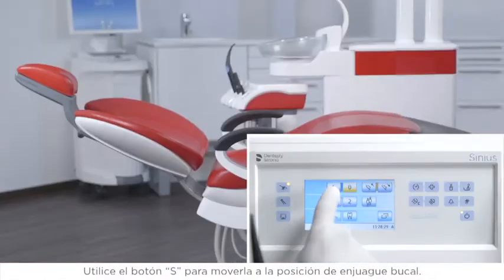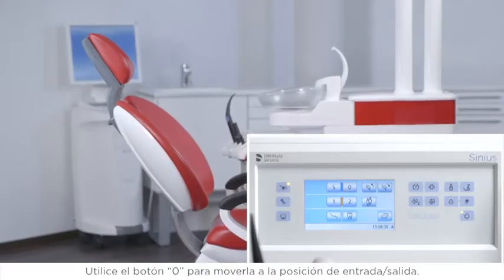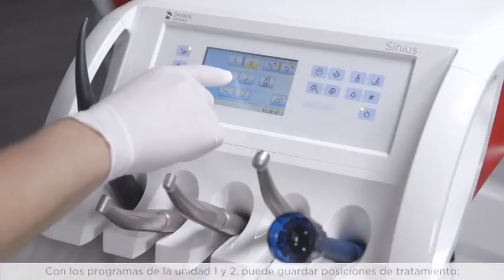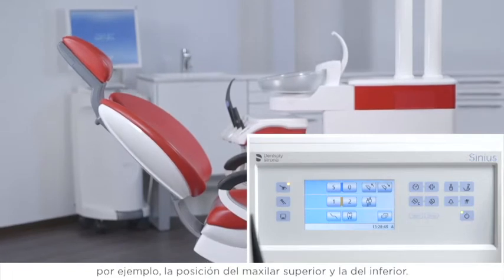Use the S button to move to the mouth rinsing position. Use the 0 button to move to the entry-exit position. With chair programs 1 and 2, you can save treatment positions, for example, an upper jaw and lower jaw position.